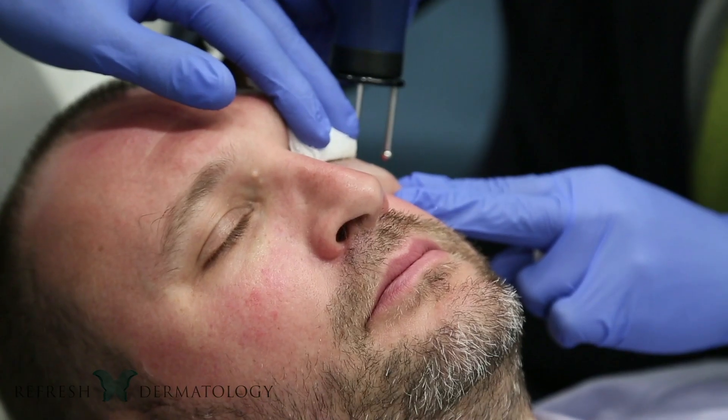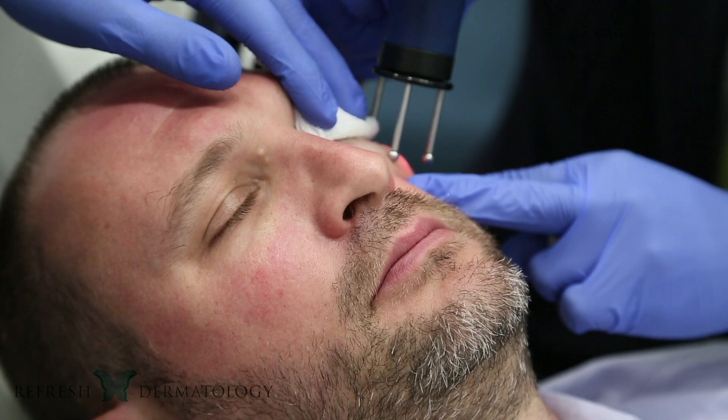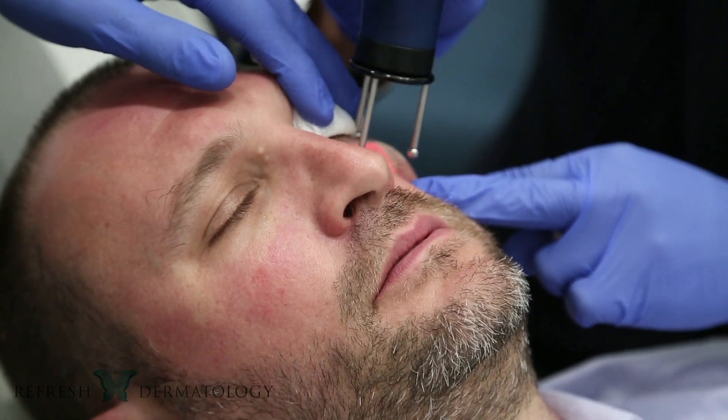I like to make the analogy that if you've been to a golf course and seen them when they've aerated the lawn — they've taken little plugs out — the laser does something very similar. It's drilling micro holes into the skin, and then the skin tightens back up as it heals.